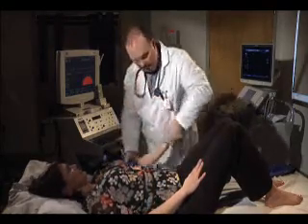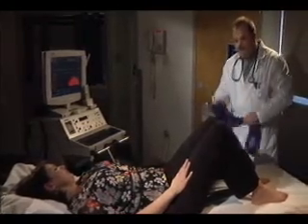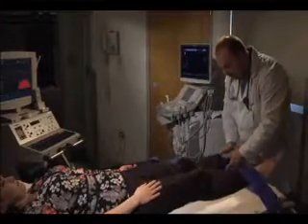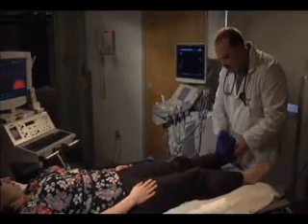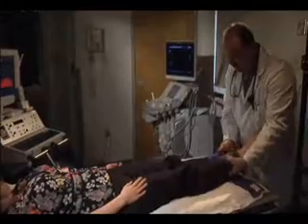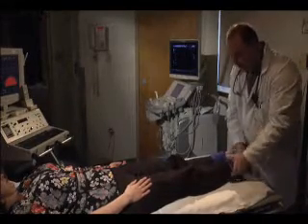Yes. If this screening study determined that there was a blockage in the legs, you would have a formal arterial study where we did all the cuffs. Normally we have eight cuffs placed down the legs. We also have cuffs on the feet and the toes. And we do what are called pulse volume recordings, which measure the expansion and contraction that occurs with every heartbeat in our arms and our legs.